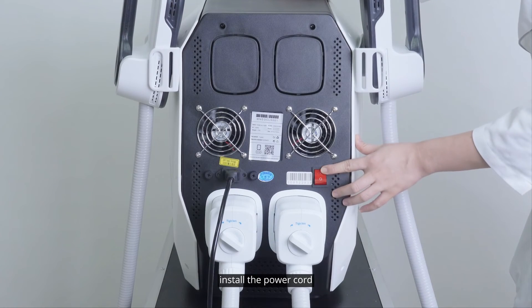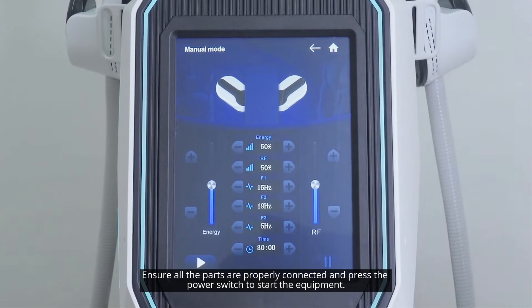Install the power cord. Ensure all the parts are properly connected and press the power switch to start the equipment.